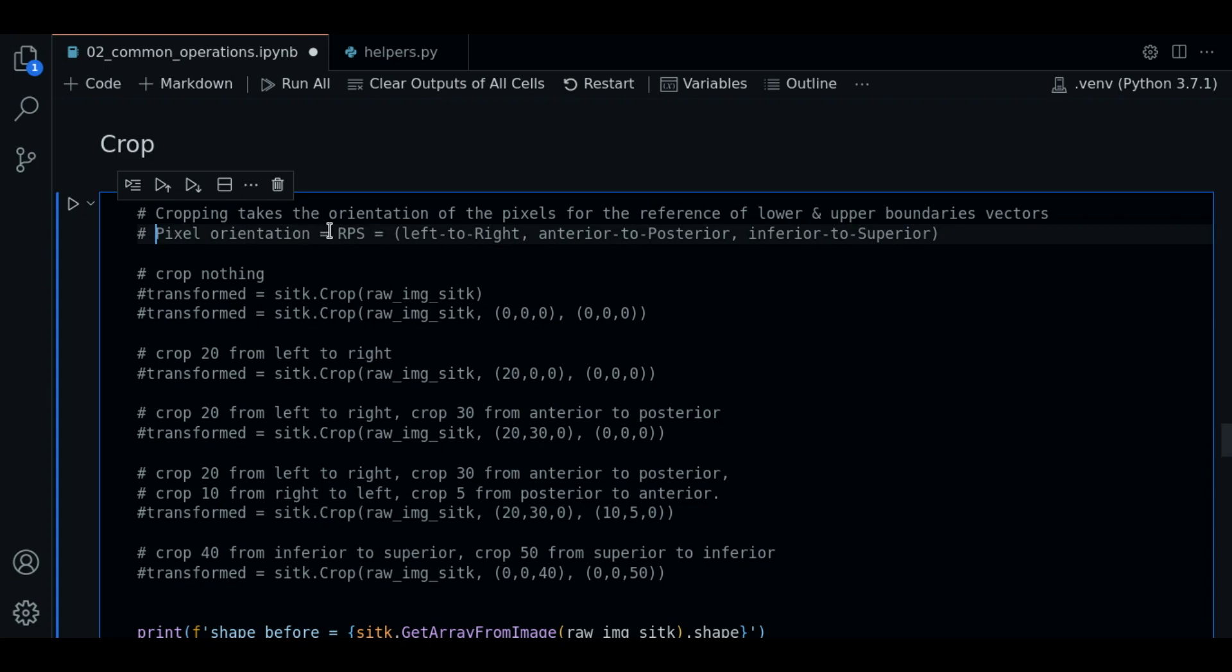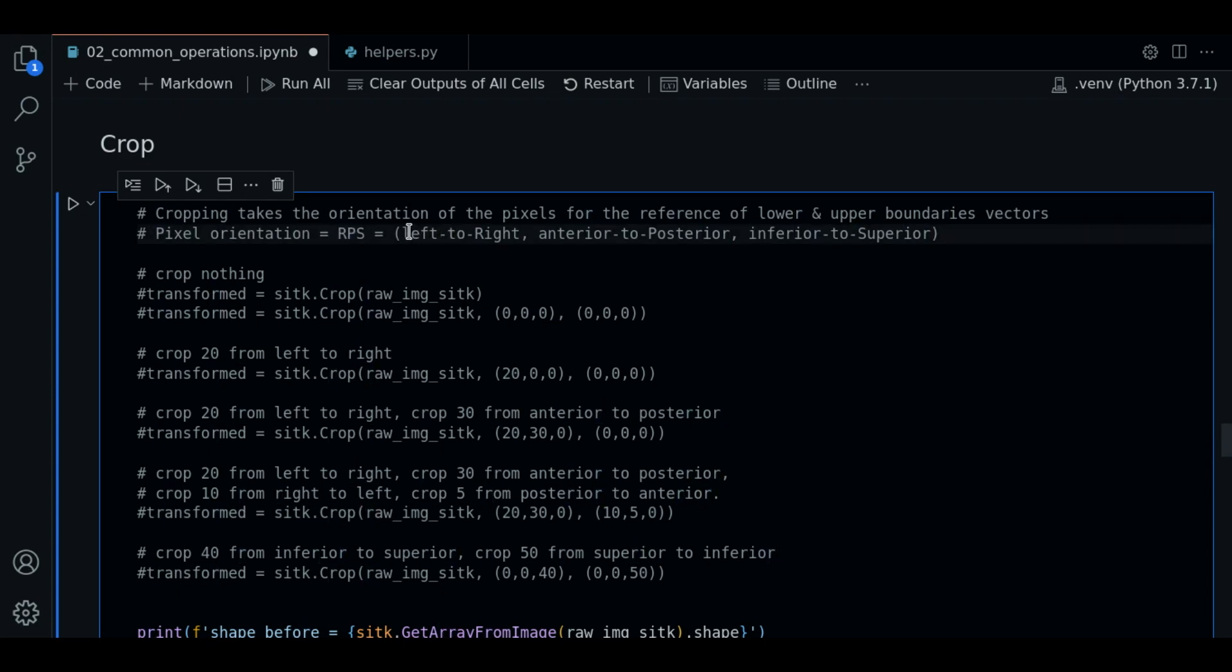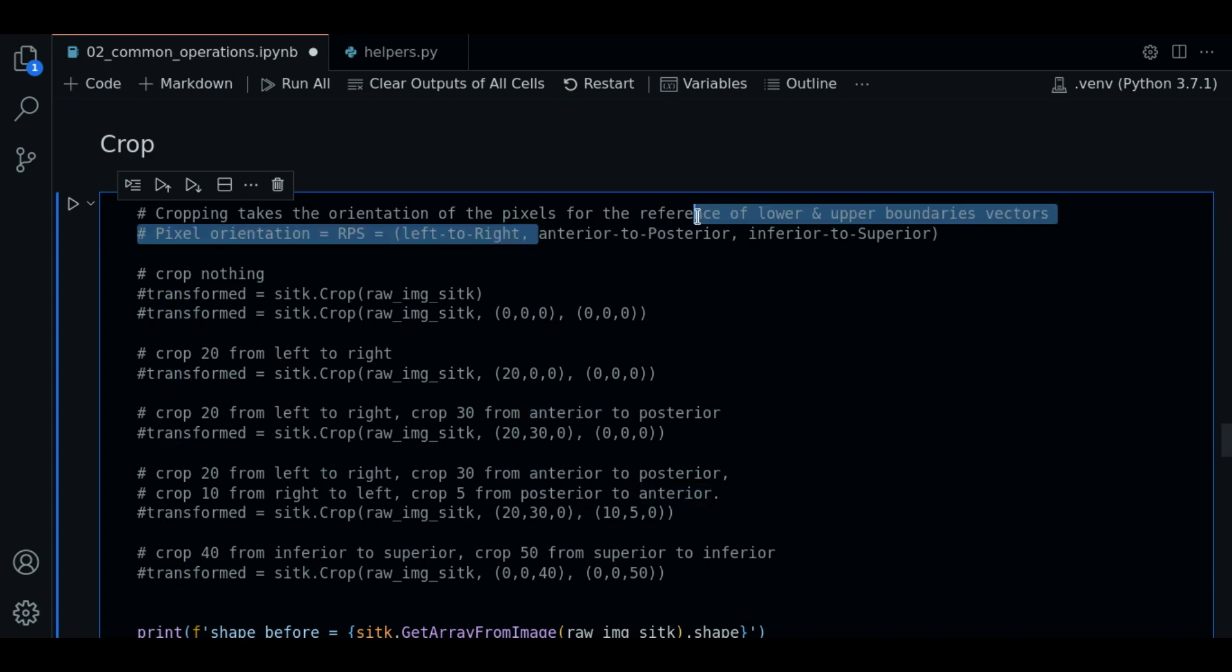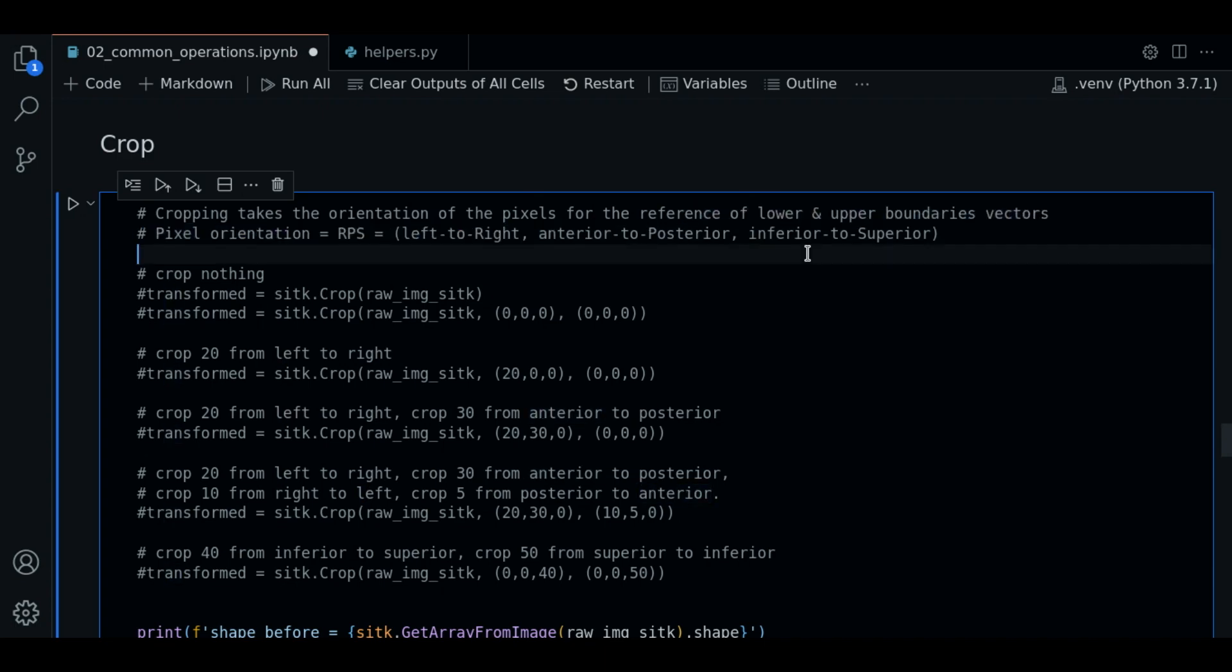If we remind the orientation we are working, it's RPS which means left to right in first axis, anterior to posterior in second axis, and inferior to superior in third axis.